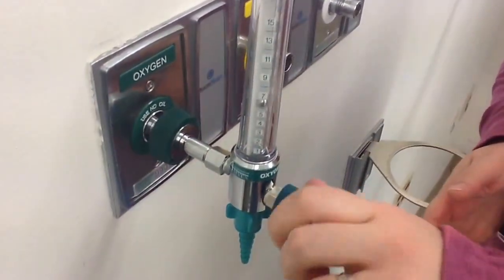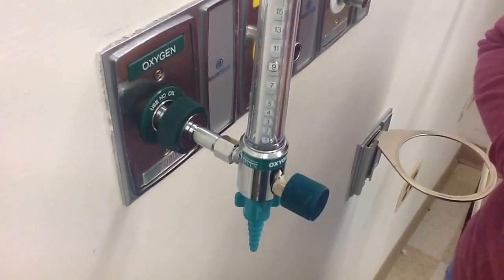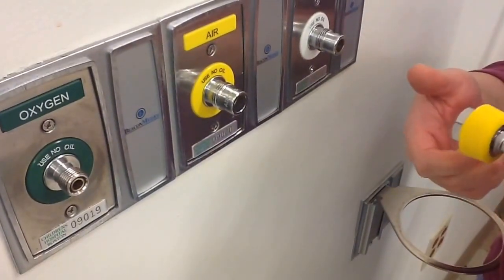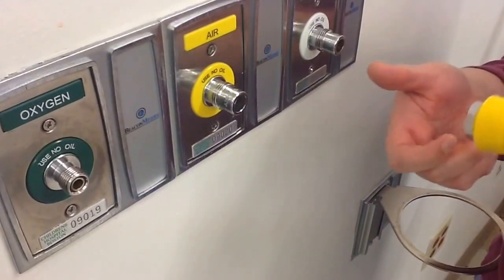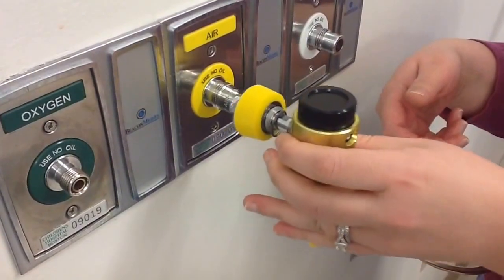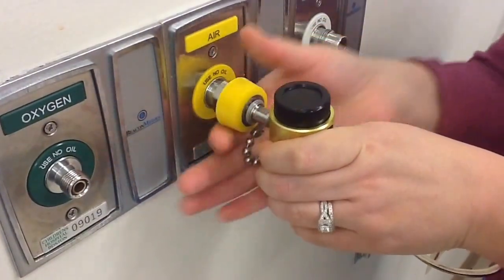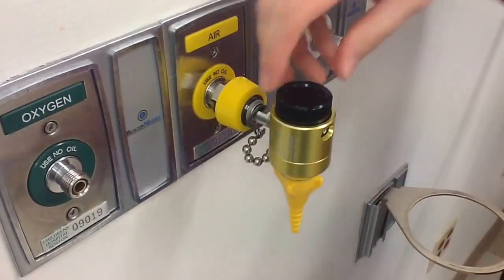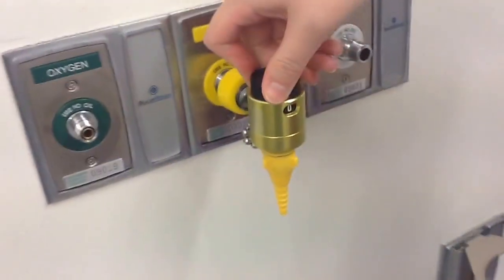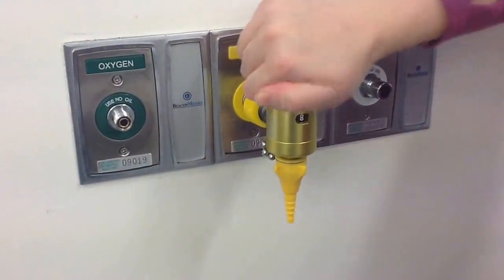When you turn it on, make sure that the ball is going to go up and it's going to stay. So if you have a trach patient requiring humidity but not an oxygen requirement, call respiratory. We'll bring you an air flow meter. You want to make sure that when you connect it, it's connected to the air. It's the yellow. And as you screw it in, you want to make sure that there's air coming out of it. So the only 2 things you can have are either off or on at 8.